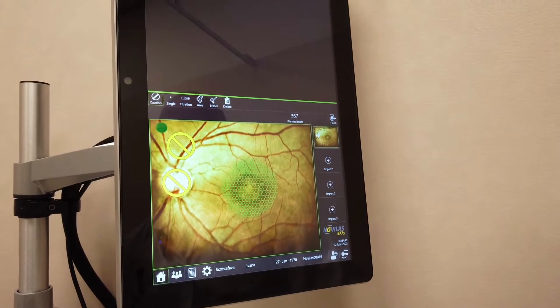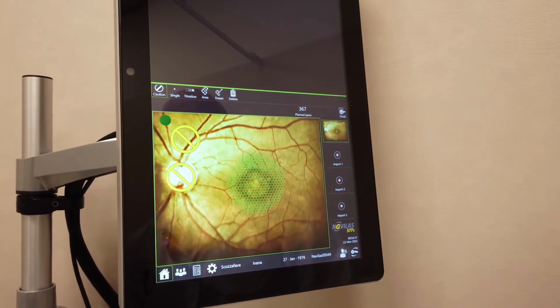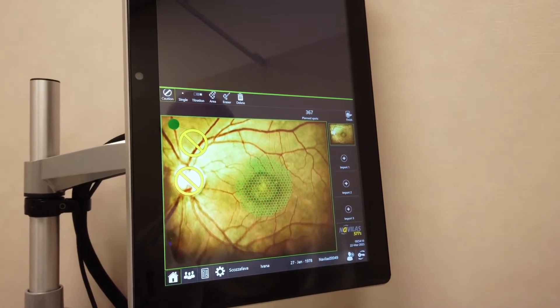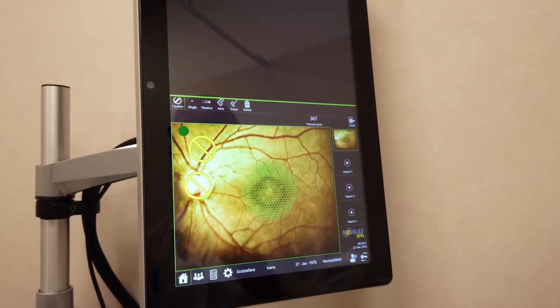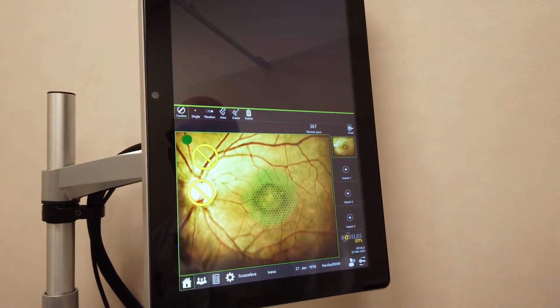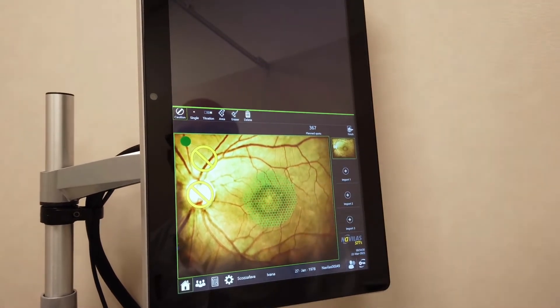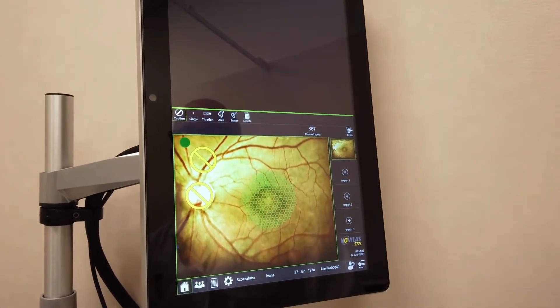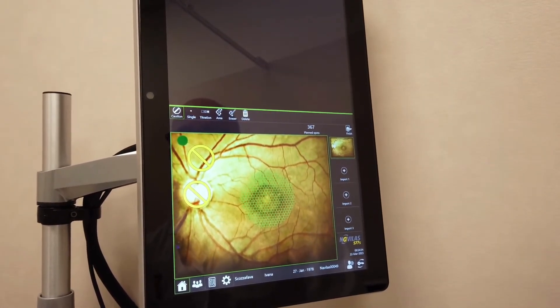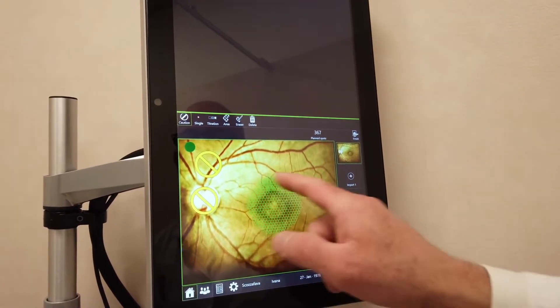After finishing the planning, we move on to the execution of the treatment. The patient sits in front of the machine, the laser recognizes the patient, and basically overlays the image that we have acquired with the real image. At this point, automatically, with an active eye tracking system that tracks the eye if it moves, it performs the laser treatment.